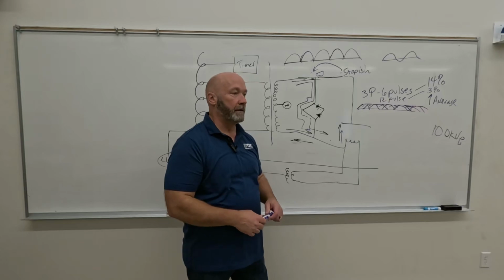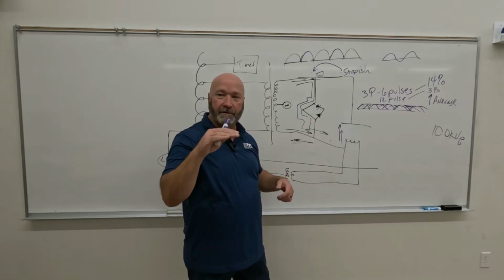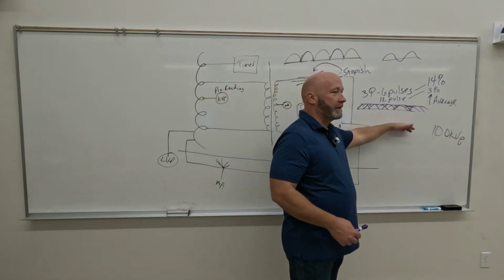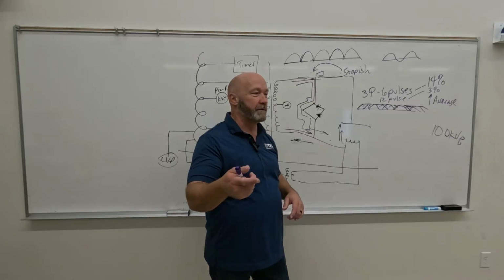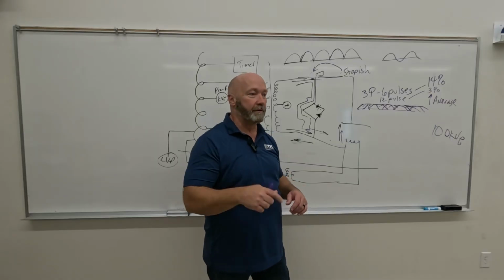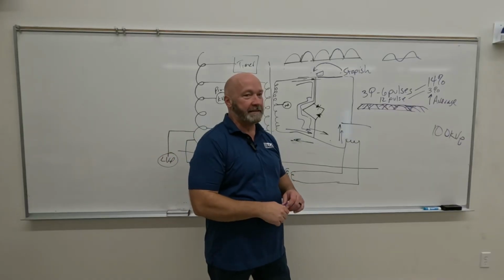Exactly. That's what they refer to as a chopper circuit. It chops the top off of the voltage waveform, right? It's a chopper circuit. And that's the circuit that you can actually hear sometimes when you make an exposure. If you're working in certain high frequency rooms, you make an exposure and you hear this whining sound. And it's not the beep at the control panel, it's in the room with the x-ray tube. And it's actually coming out of the generator box and it kind of goes zzz, like that.